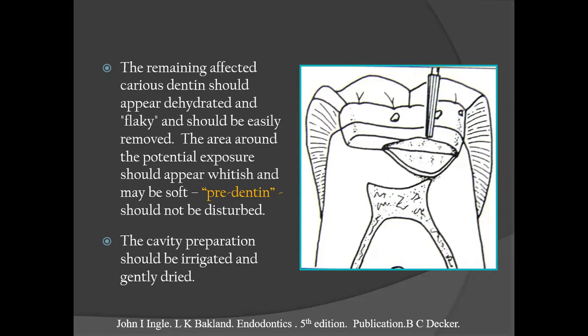Then the area around the potential exposure should appear whitish and maybe soft. That is the pre-dentine. Once you remove these flakes, you can see the dentine there, the tertiary dentine that is formed. It will be very white in color, and when you touch it, you will feel that it is going for an exposure. So that area you have to keep. That's the pre-dentine formation, which is how the dentine forms. Do not disturb that.